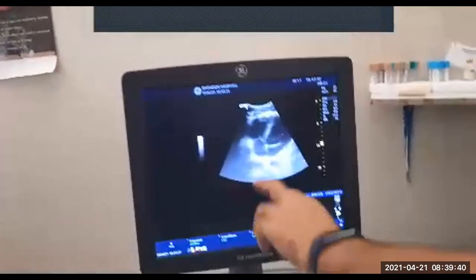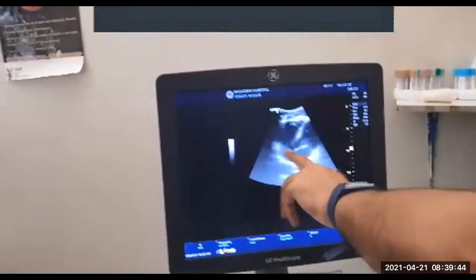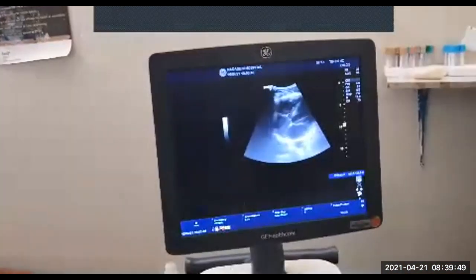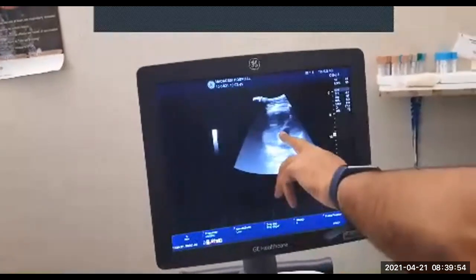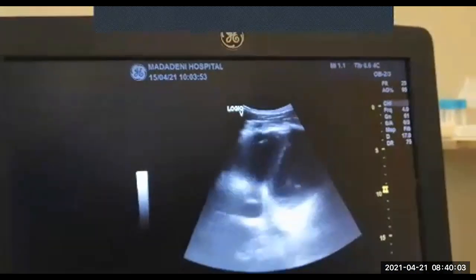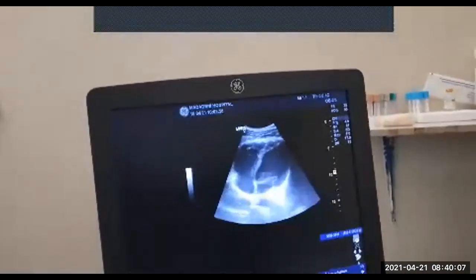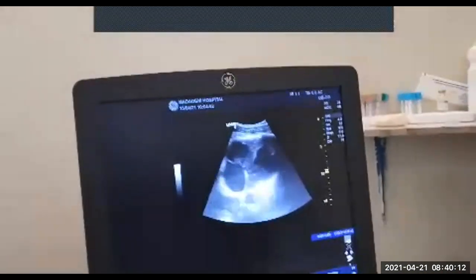All right. So what we see is the right ventricle, left atrium, right atrium, tricuspid valve, mitral valve. And if we move around a little bit, we might even be able to see the aortic valve. Can you see it there? This little thing that's pumping away over there. This is also called the 5-chamber view sometimes because you can see all of the heart at the same time. You can see what a good view it is, because compared to all of the other views, we've actually got the best view of the heart from the apical view.